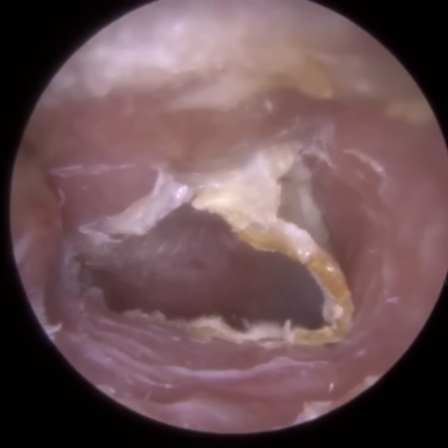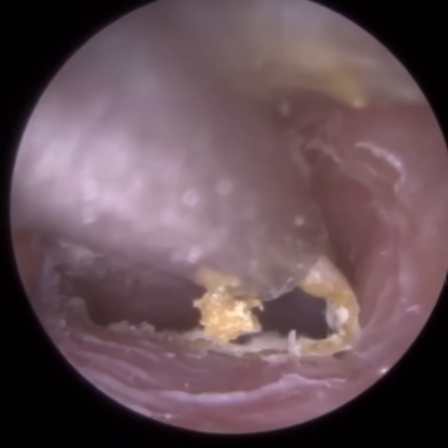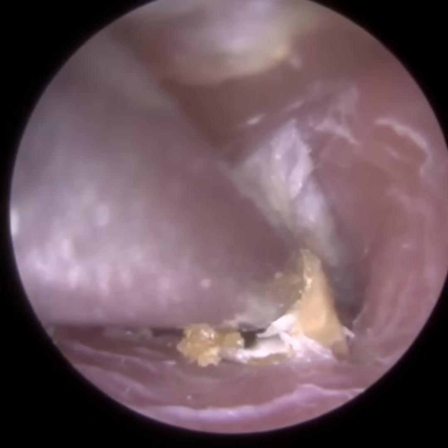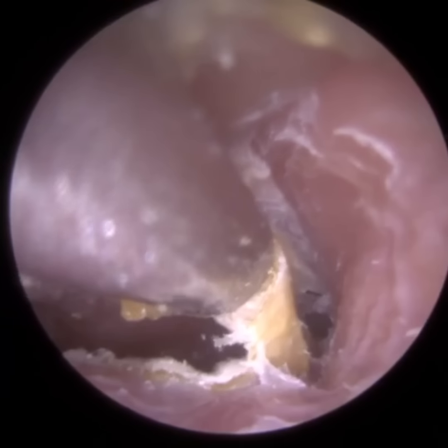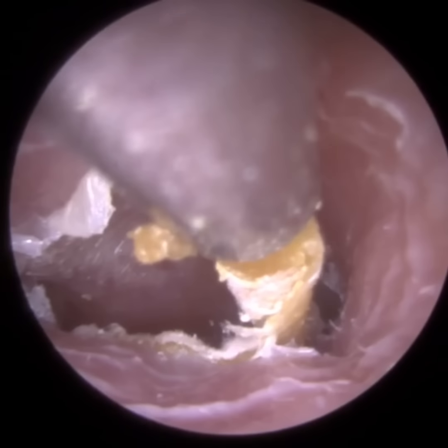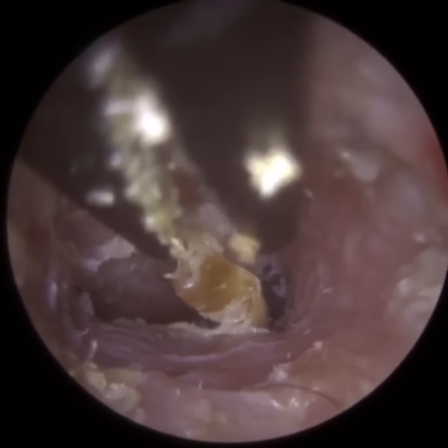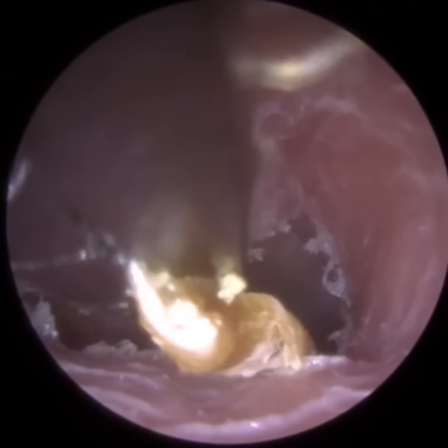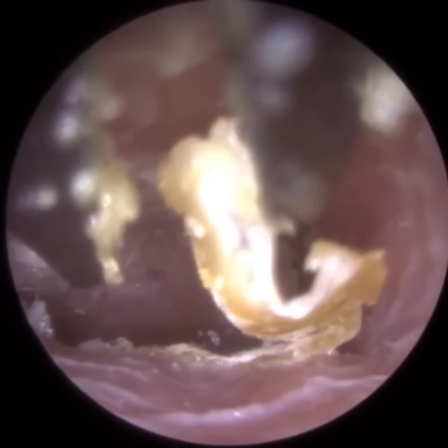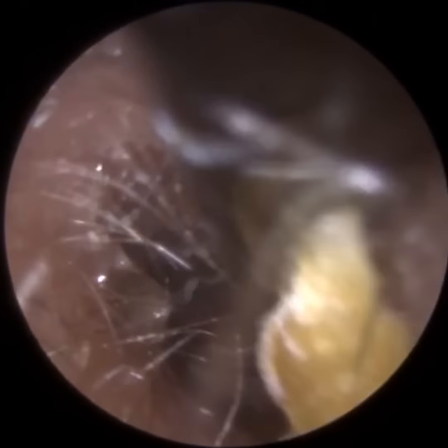So we can just see the hammer bone of the eardrum there, and you will get a close-up in a minute. Just see the inflammation here, the edema, the swelling of the ear canal. If you look to the right, you'll see that little blood mark just there on screen. So that's where the plug started off. If you remember, when I was initially removing that plug and I was trying to lift the plug off the back part of the ear canal wall, we were getting that contact bleeding. So you can see how deep we've had to go, how extensive this plug was, how deep it was in the ear canal.